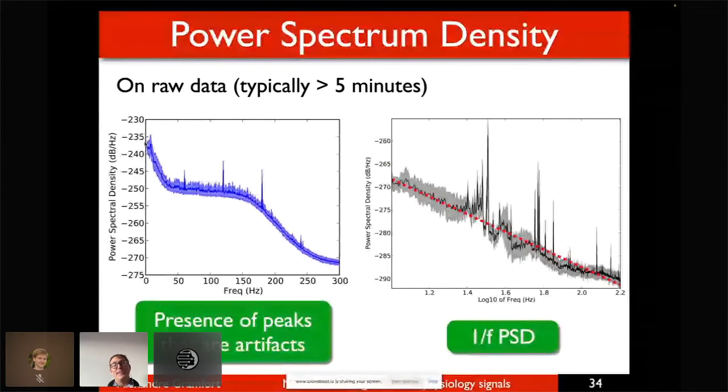I don't know if it's clear, I cannot see you right now, but I want to insist that the power spectral density will tell you how much the raw signal is actually dominated by certain frequencies. And imagine that this peak goes very high, imagine that this peak arrives here. If this happens, it means that if you look at your raw data, you're going to see mostly the harmonic at 120 Hertz.